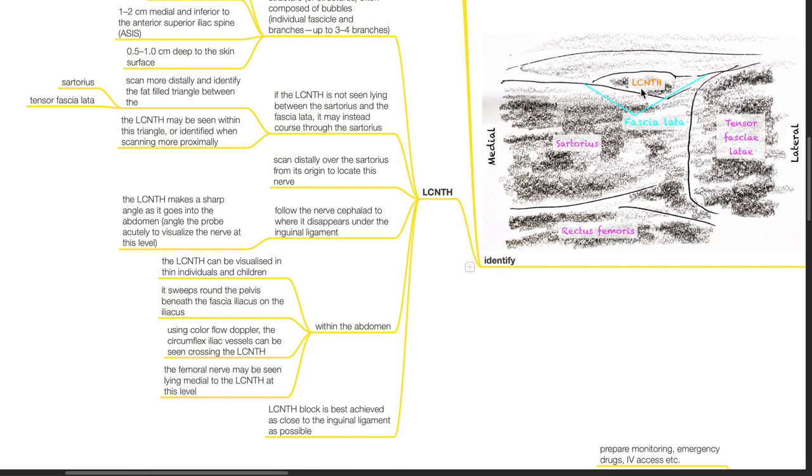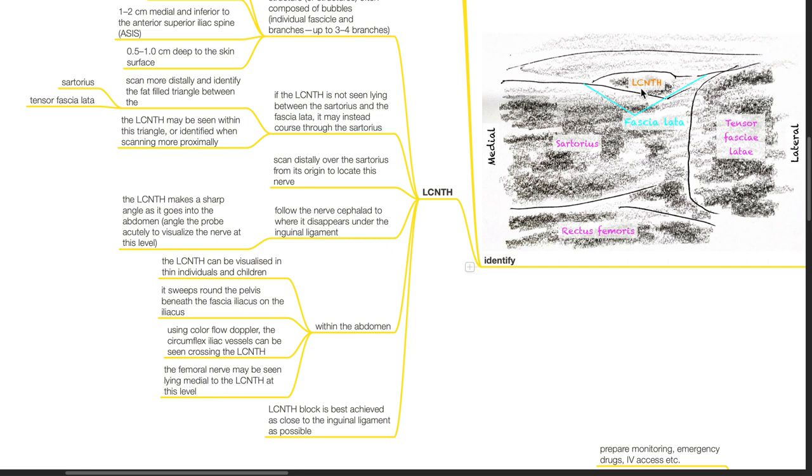Follow the nerve cephalad to where it disappears under the inguinal ligament. The LCNTH makes a sharp angle as it goes into the abdomen. Angle the probe acutely to visualize the nerve at this level. Within the abdomen, the LCNTH can be visualized in thin individuals and children. It sweeps around the pelvis beneath the fascia iliaca on the iliacus.